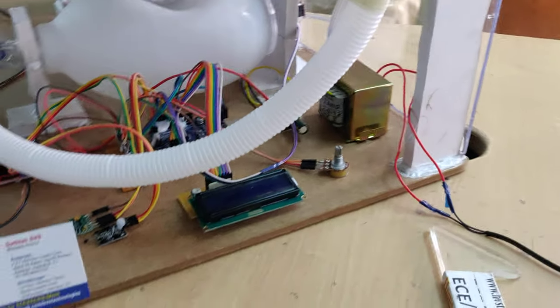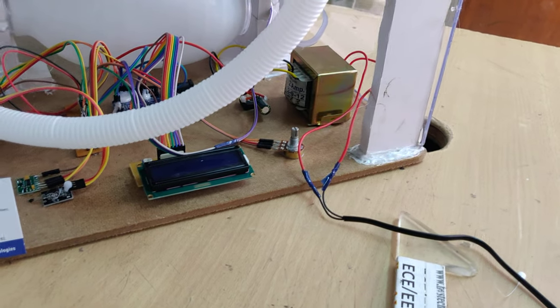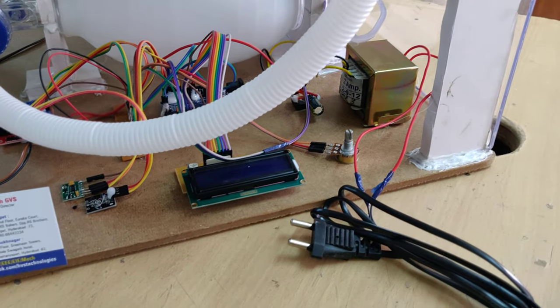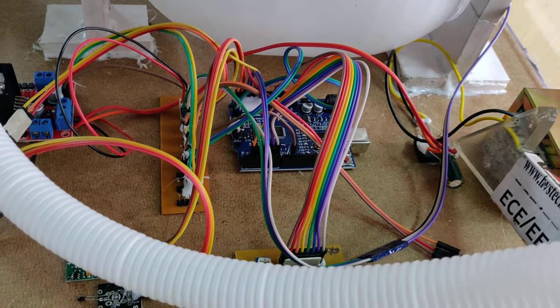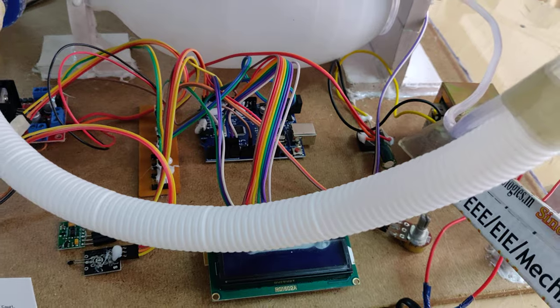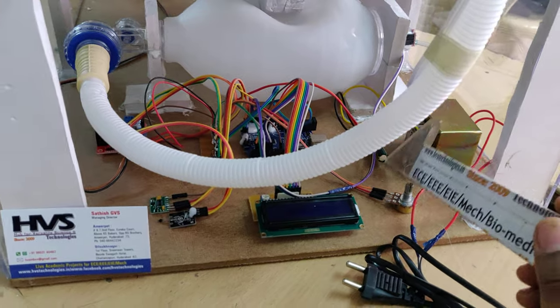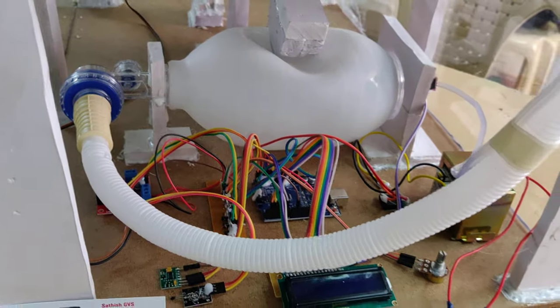The whole system gets power supply from this 12 volt 2 amp transformer, which takes 230 volts AC input and provides us 12 volts AC output. That 12 volts AC is converted into 12 volts pure DC with the help of this regulated power supply section. There we can see the black color is a rectifier, the KBL10, and this one is the capacitor which takes the pulsating DC coming from the KBL10 rectifier and provides constant DC. When we provide that constant DC to the L298 motor driver, it provides us 5 volts DC output, and that is distributed throughout the modules through this breadboard.